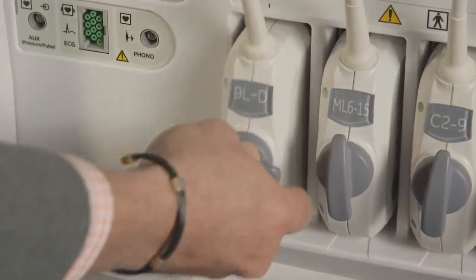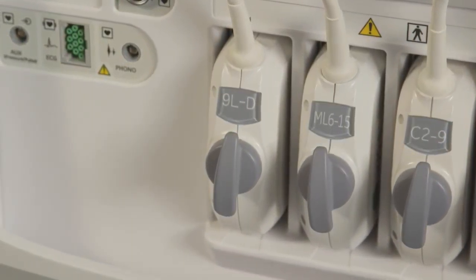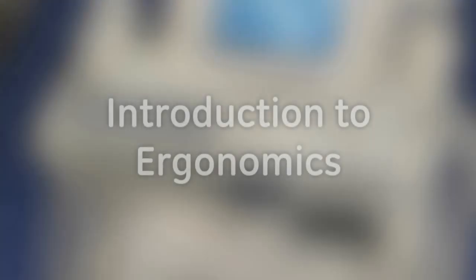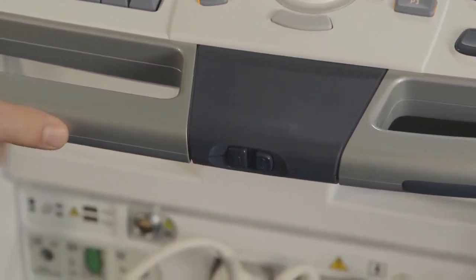USB ports are located on the machine for convenient export. On the Expert Series, there are two USB ports located on the left side at the top of the system, and two more are located on the back inferior portion of the machine near the main circuit breaker. On other Logic systems, the location may vary. To stop the USB device before removing it from the system, press the F3 eject key on the keyboard.